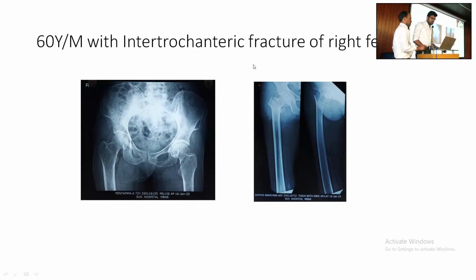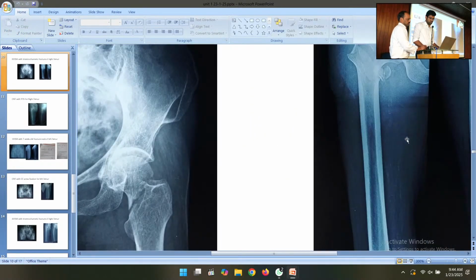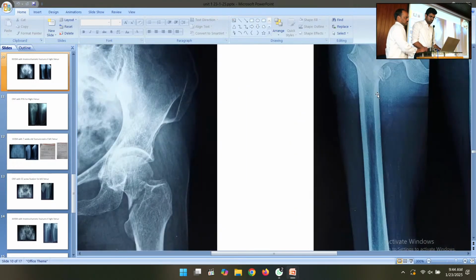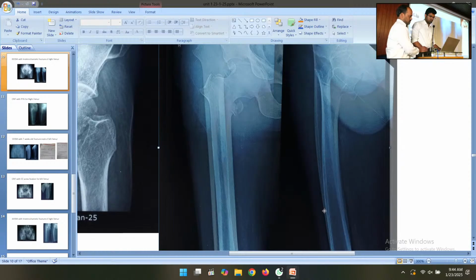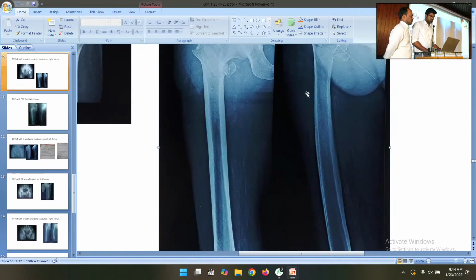Zoom the image. Is it basicervical or intertrochanteric? Intertrochanteric. Intertrochanteric only, no? Yes, sir.